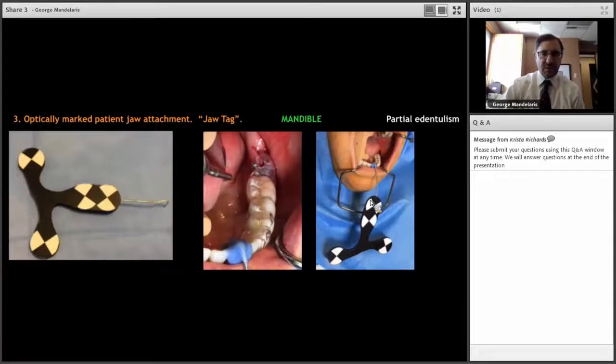We've got our jaw tag, as you see here, but I still like to use a belt and suspenders approach. So we're going to optically scan the patient after the CBCT scan. We're going to upload that data to a dental laboratory that we're going to work with to do a digital diagnostic wax-up. The digital diagnostic wax-up STL file will then be sent back to us and registered to the CT scan using the Navident software. We'll stitch the two files together so that when we execute, we're executing from a prosthetically directed position from a mesial-distal, buccal-lingual, and apical-coronal position.